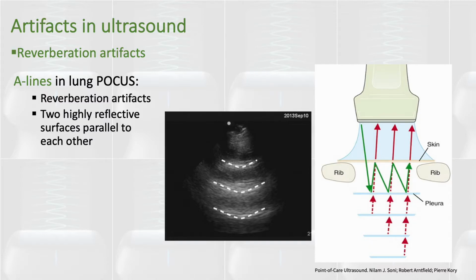So compared to, for example, CT scan and MRI, we always complain about finding artifacts in these images. In ultrasound, actually, artifacts can be useful. They're not 100% all the time useful, but most of the time, actually, they are useful. And they can help delineate normal anatomy from different pathologies.